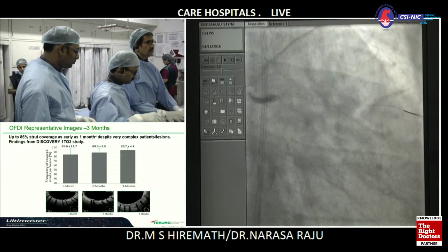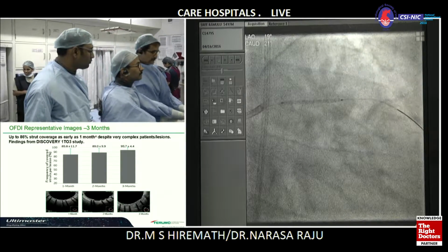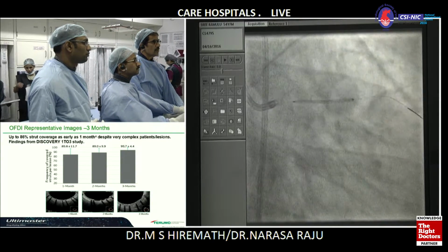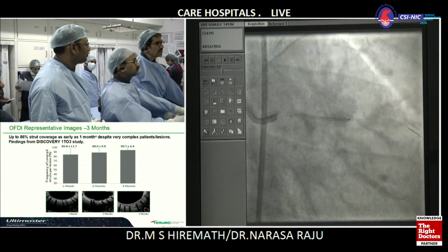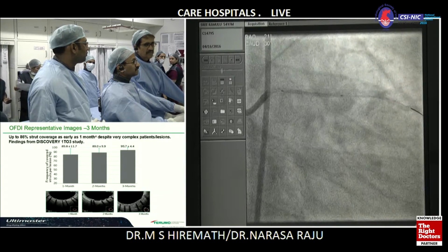Don't you think the 4 is a little extra for the bigger distal vessel, LAD? No, we saw the LAD. Or 3.5 or 3.2? So Rajiv, you arrived on the scene late. You should have told me earlier. I would have taken 3.5.